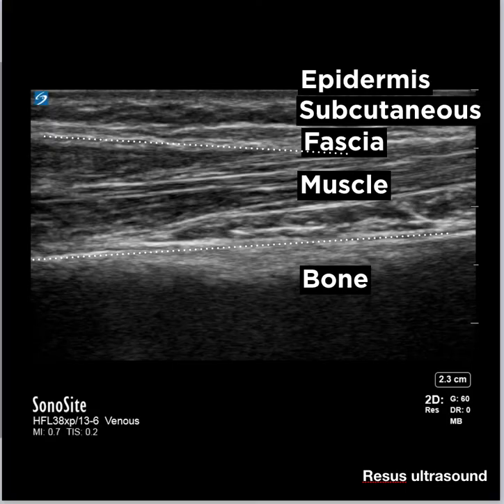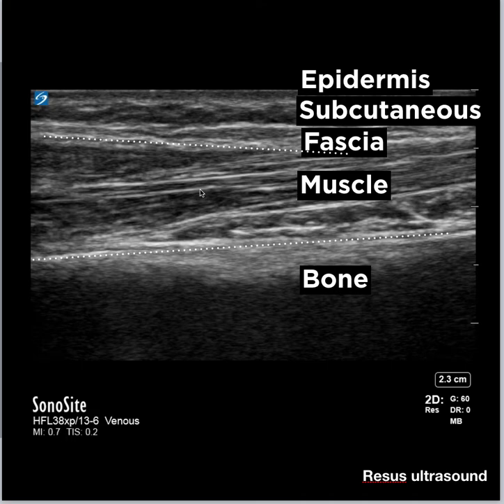In basic ultrasound anatomy, you look from below. You find bone, which appears as a shadow. Above bone, you see muscle, which has a striated pattern like meat. Above muscle is fascia, which appears as a bright white thick line. Above that is subcutaneous tissue, which normally you won't see much because it's fat.